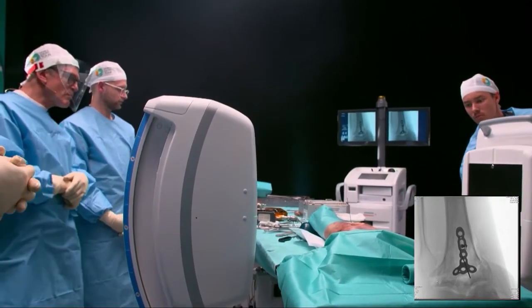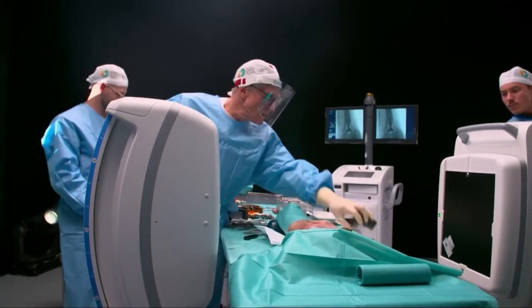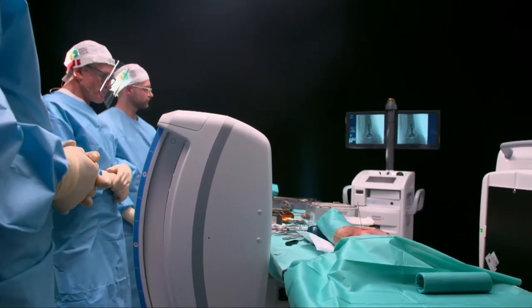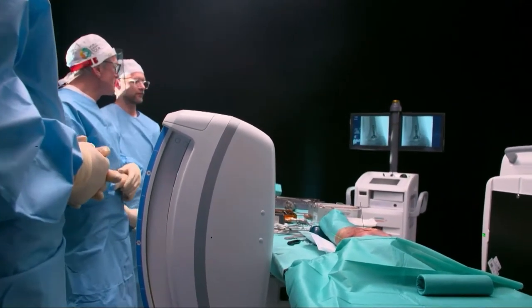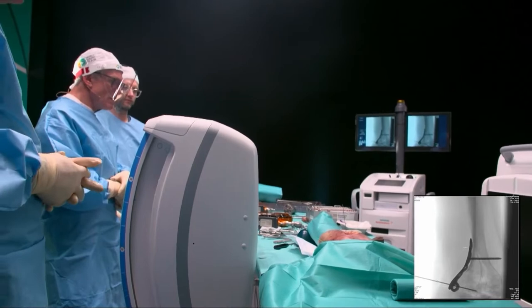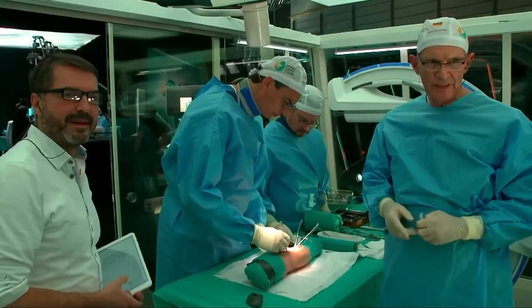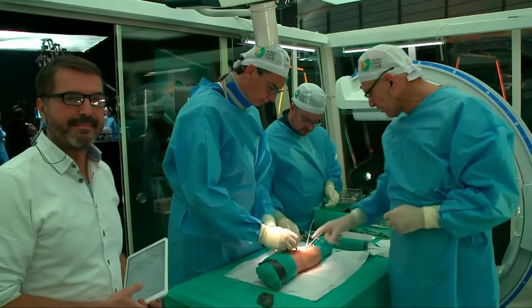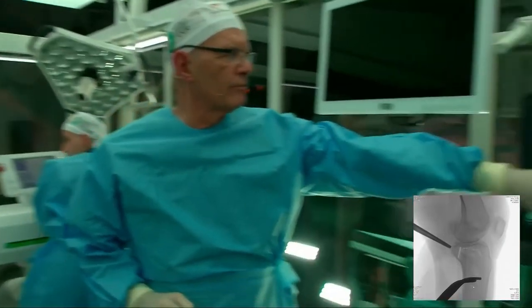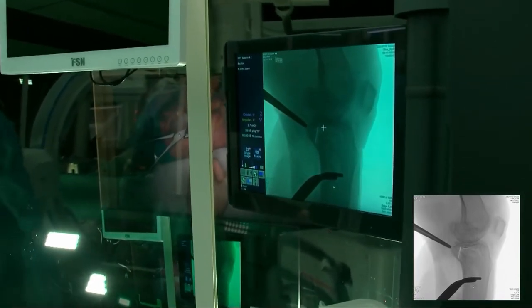As you can see in the X-rays, they reduce the bone pretty nicely and the reduction clamp holds the fragment. Bertil, your pictures look extremely nice — we reduced it perfectly, we don't see the fracture anymore. You can see the dislocated part of the posteromedial fragment and we're going to see if we can place a plate over there.